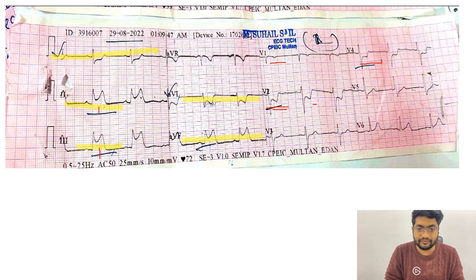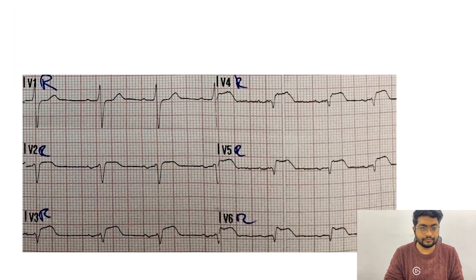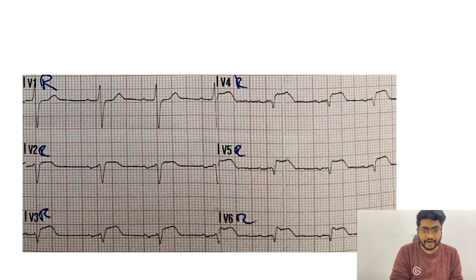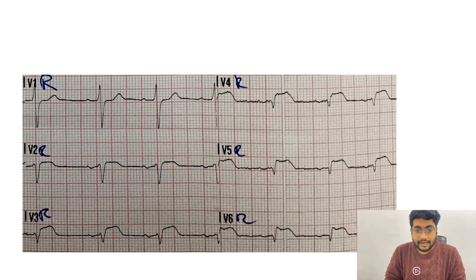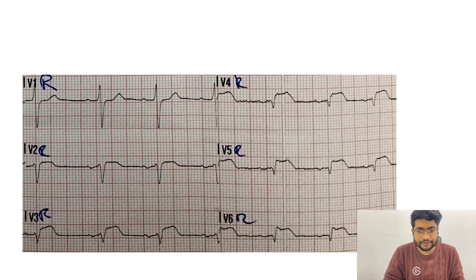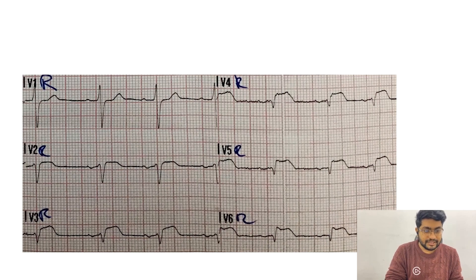These are our RV infarct leads — we put 'R' in front of V1, V2, V3, V4, V5, and V6: these are our right-sided leads. We reversed the ECG leads on the precordium, and we start seeing elevation from V3R to V6R. This confirms our diagnosis of right ventricular infarct.